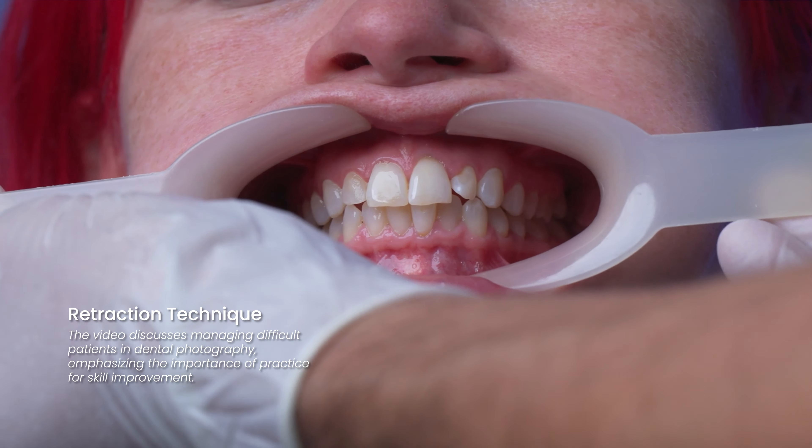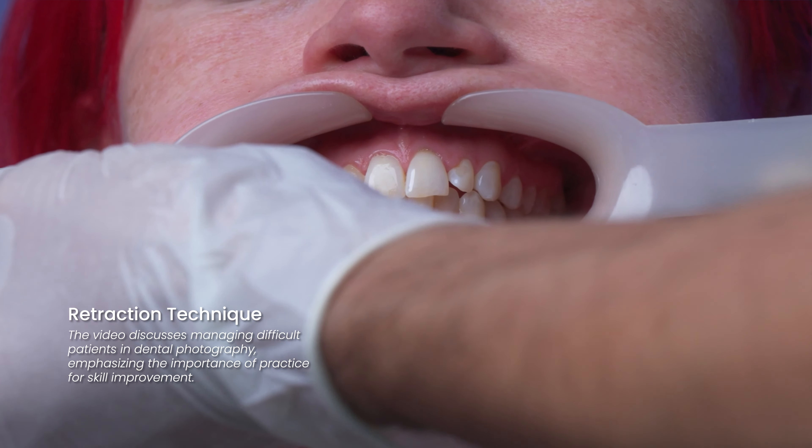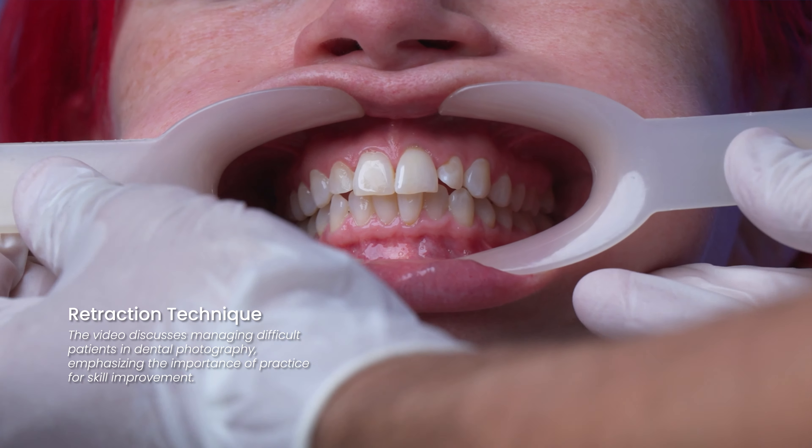I'd recommend retracting for the patient first and then asking them to hold the retractor, rather than handing them the retractors and trying to guide them.